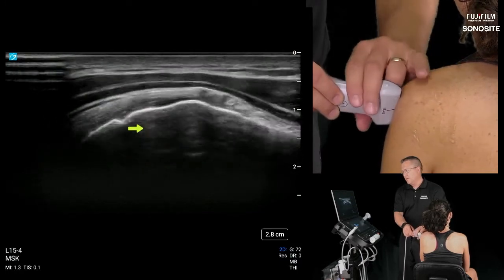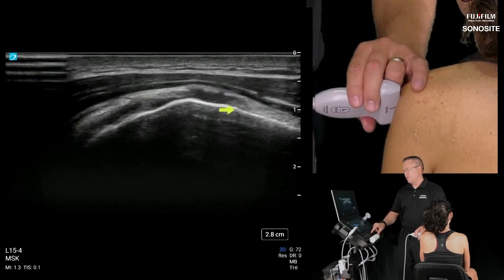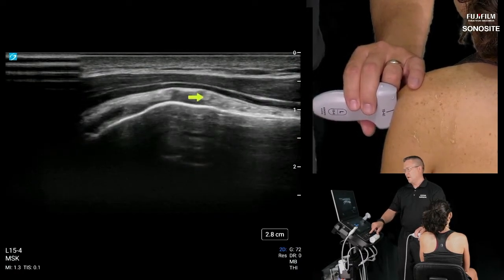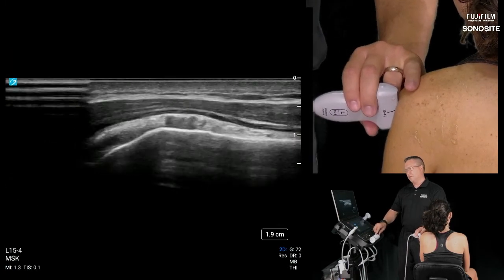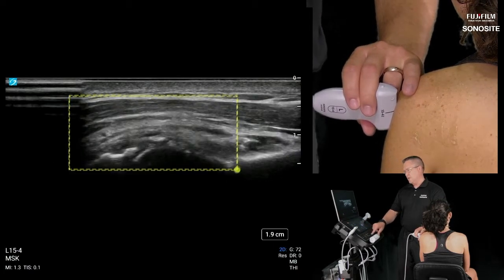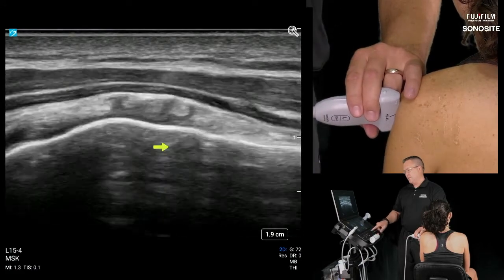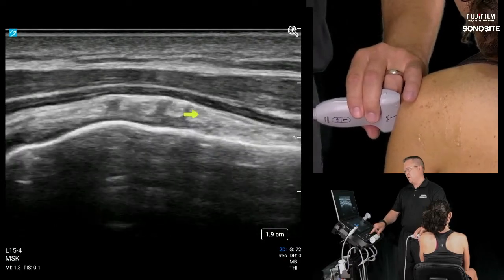There, you can see it now, up above my arrow. That's still some infraspinatus involvement. This is the facet that I'm talking about. This is the teres minor. You can even see those little musculotendinous slips, or the little interdigitated slips, kind of like we see in a subscap. I don't know if that's going to be real easy to see on Zoom, but what I can do is zoom in on that so that you can see the detail of those little tendon bundles there. So here we see very nicely individual little heads of the teres minor right there.